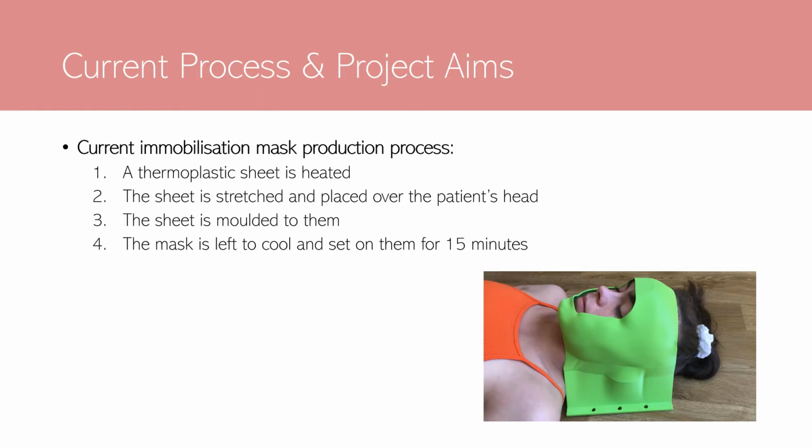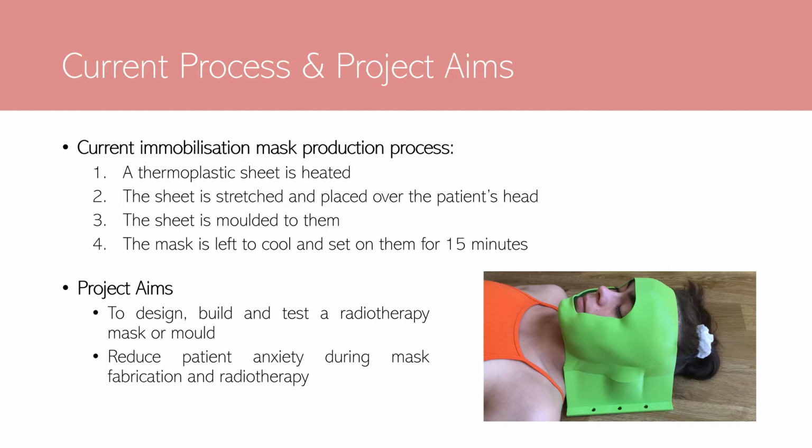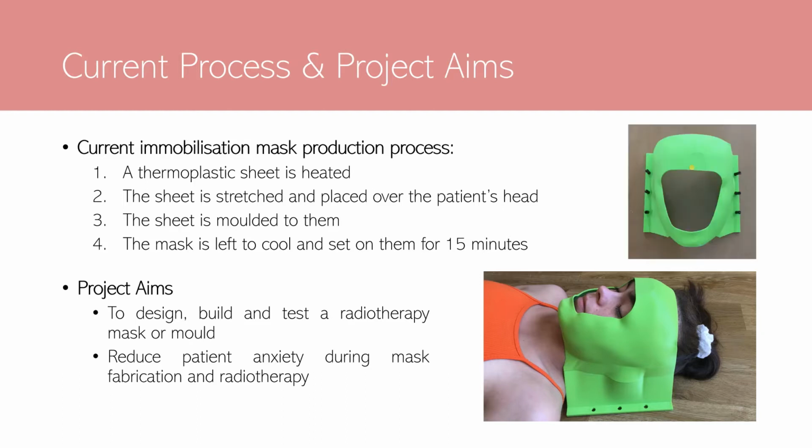Due to the contact methods used, this process can be distressing and intolerable for anyone to undergo, even more so for those who suffer with claustrophobia and anxiety. The main aim of my project was to design, build and test a bespoke radiotherapy head-only mask using non-contact methods for the design and manufacture. An additional aim was to reduce claustrophobia and anxiety experienced during the mask production process and radiotherapy treatment.